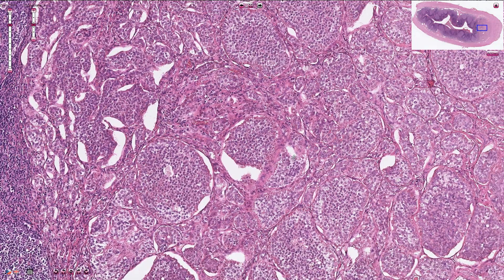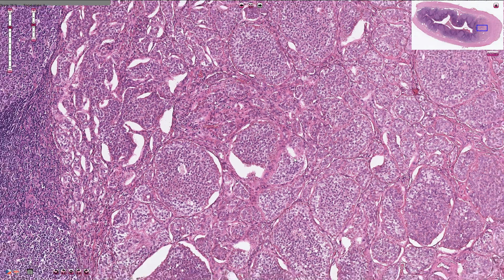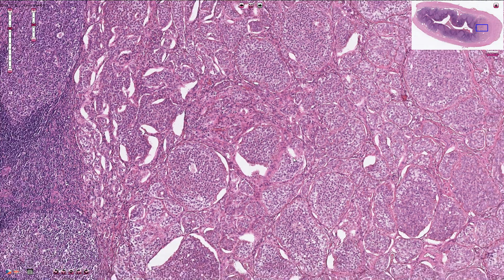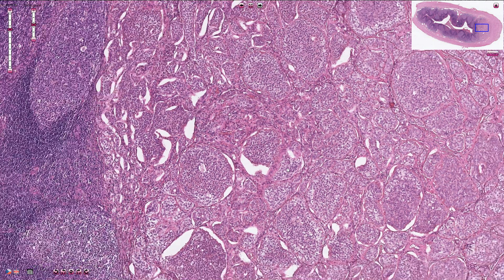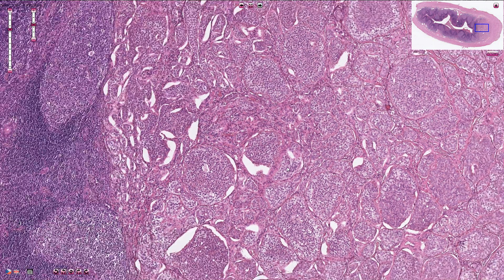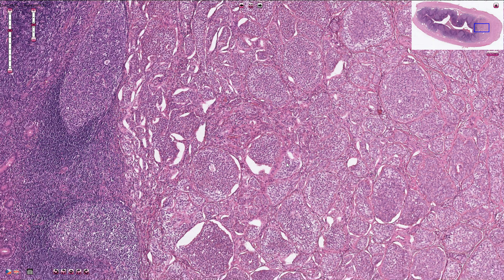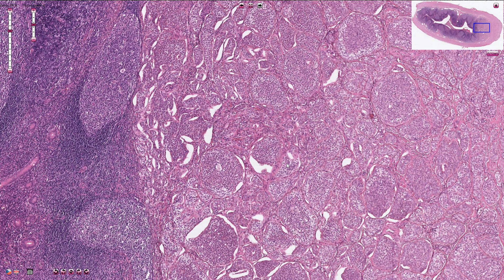We should also prove the neuroendocrine origin of these cells by immunohistochemistry. The two characteristic neuroendocrine markers, synaptophysin and chromogranin, are commonly positive.